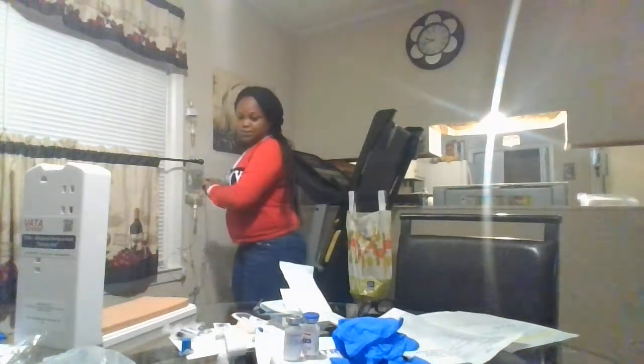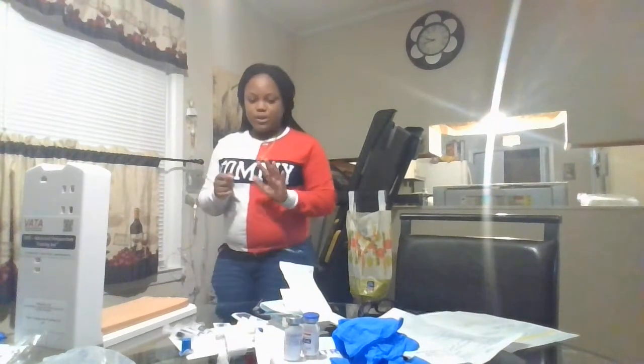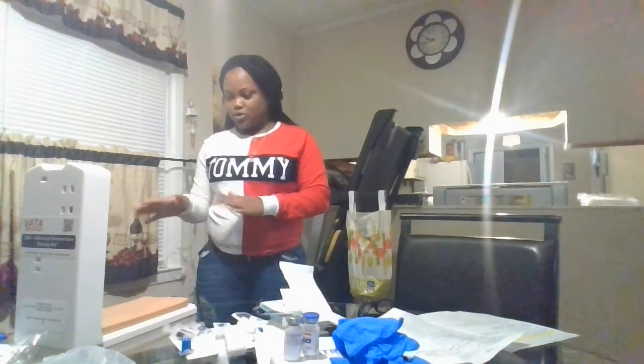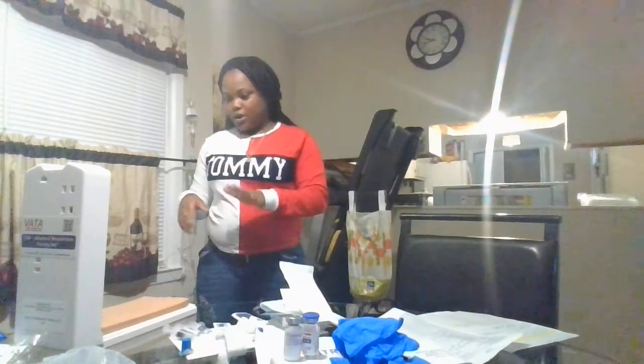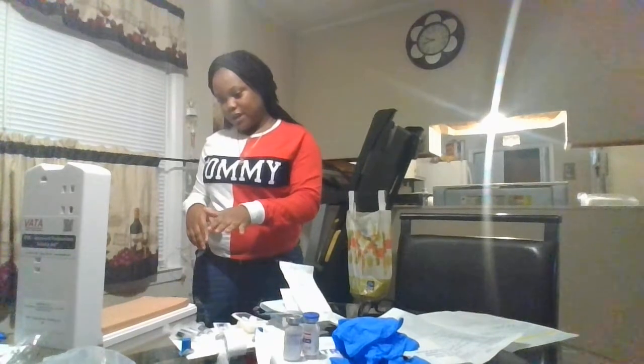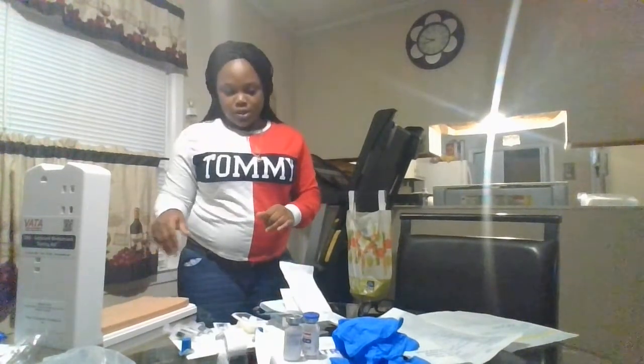I'm going to wash my hands and get my tourniquet to find a good vein. Do you have any contraindication on which side I can stick, or anything? All right, you have a shunt on your right side, so we're going to use your left side.